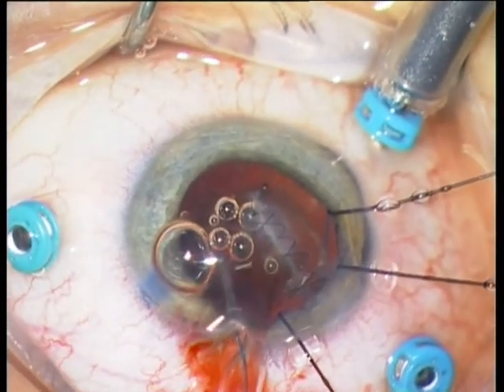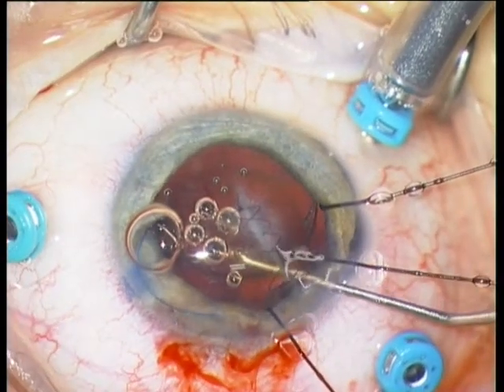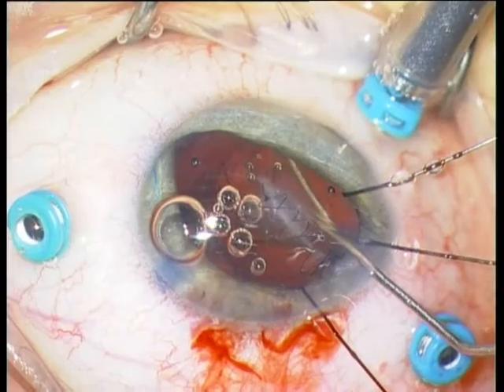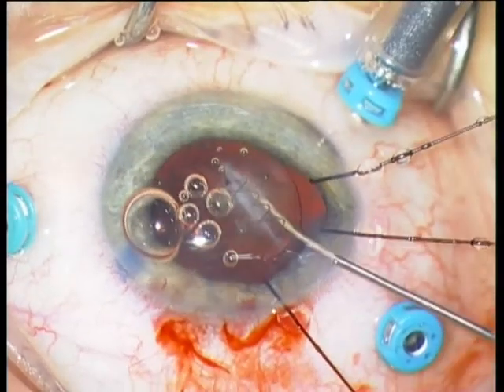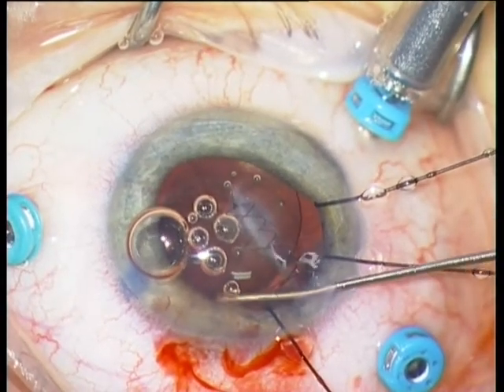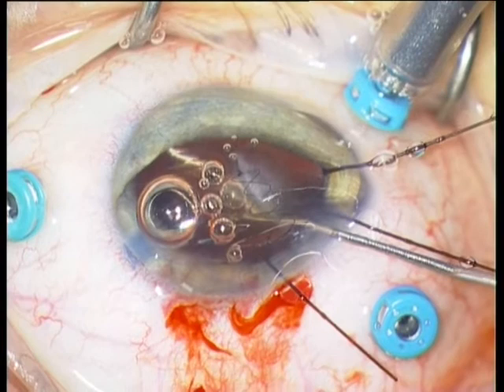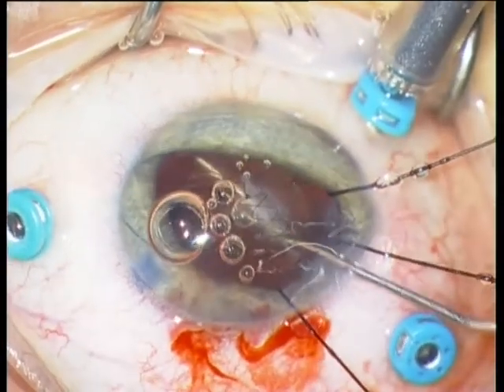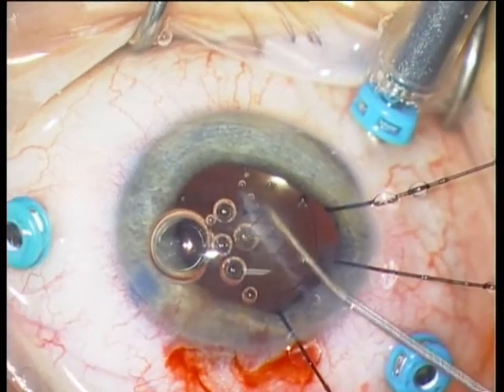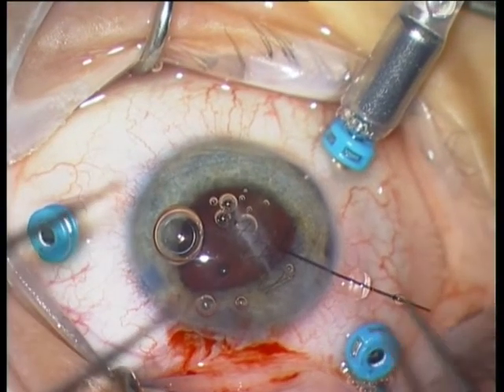I am now implanting an IOL — of course I am implanting the IOL into the sulcus. I am using a push-pull instrument from Geuder, very nice for this maneuver, because you can easily move the haptics with this instrument. I am removing the iris retractors.